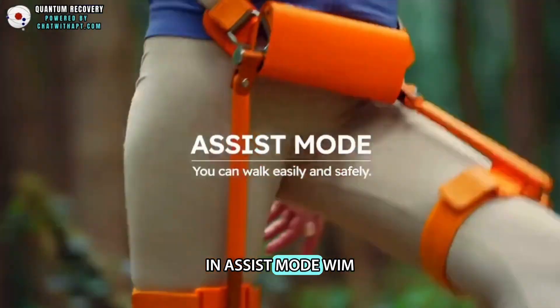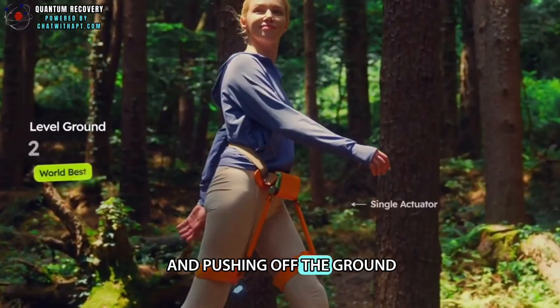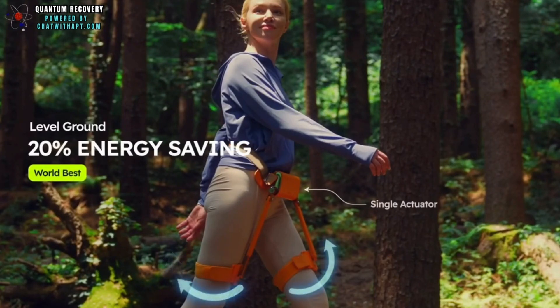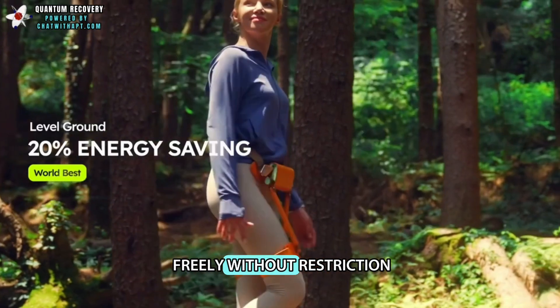In assist mode, WIM makes walking easier by lifting your legs and pushing off the ground, reducing the energy needed by up to 20%. It also improves posture, allowing you to move freely without restriction.